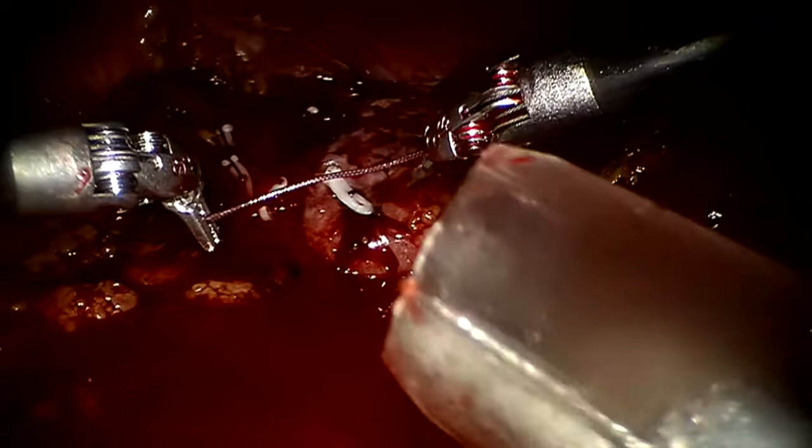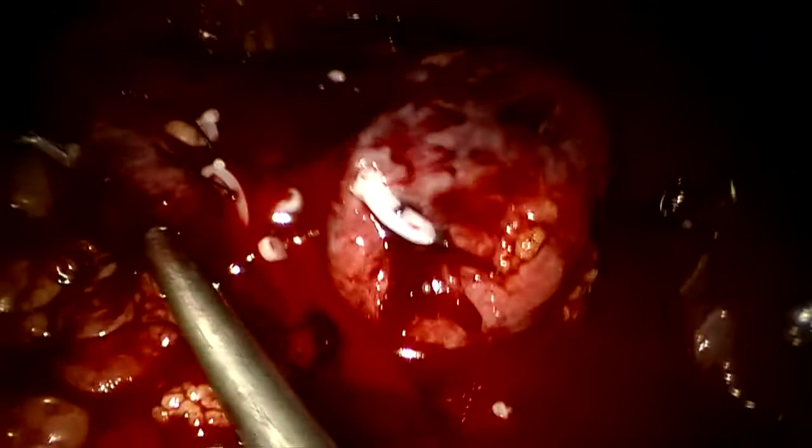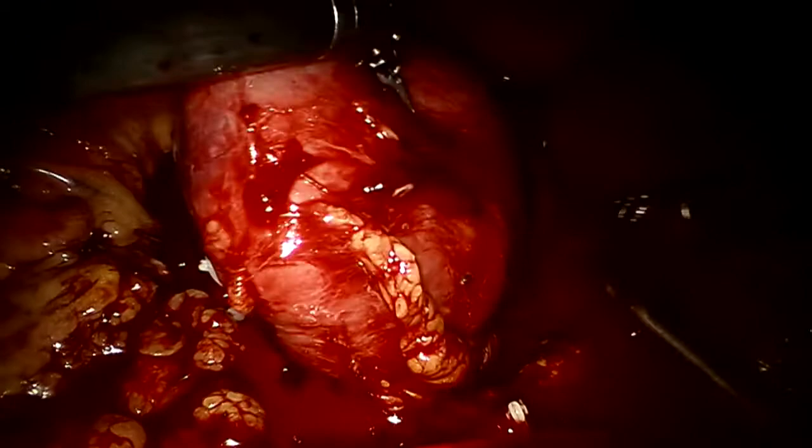Clean up the camera, please. Suction. We'll flip the kidney over, see how it looks on the other side. Camera clean, please. Now, if this tumor had not been so deep and so much involving the parenchyma, then we could potentially, at least in LA, we would have gone at it initially unclamped, trying to get the vascular. Okay, see, this looks nice and pink too now. See that? That's all good. Yes. Let's see what the front looks like.